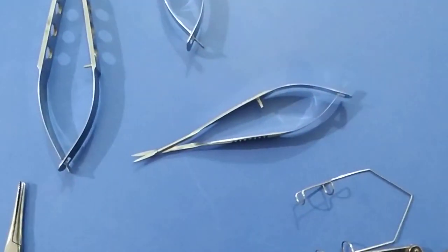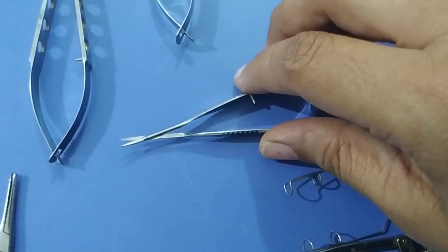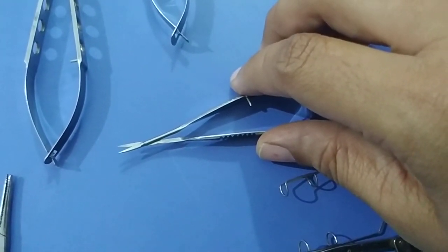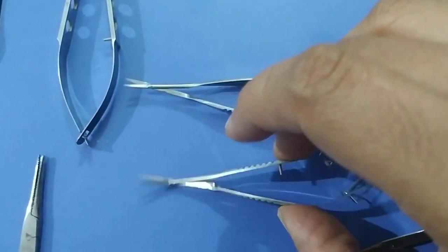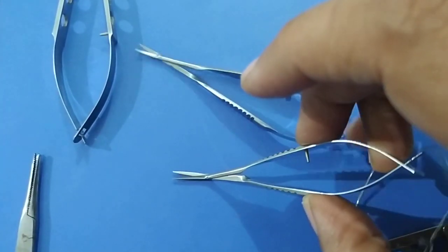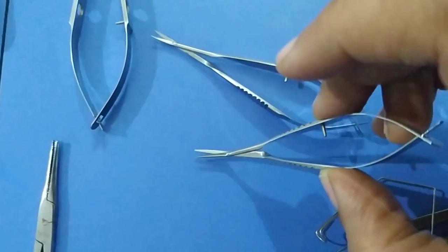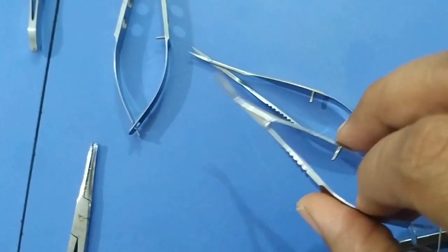Vannas scleral scissors is mainly used to cut the inner window and to cut the peripheral iridectomy during trabeculectomy. It is also used to cut the short ends of sutures. This is a capsulotomy scissors. It is used to cut the intracapsular area when there is calcification of the capsule. It is also used to cut the vitreous — prolapsed vitreous during any type of cataract surgery.